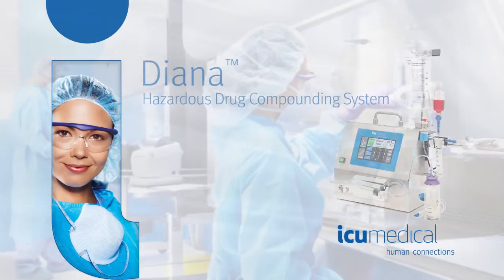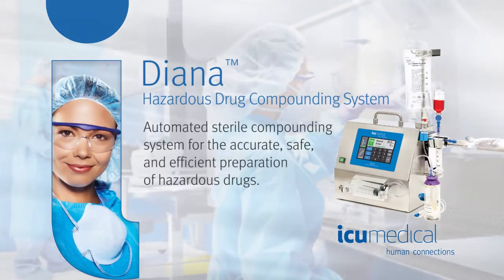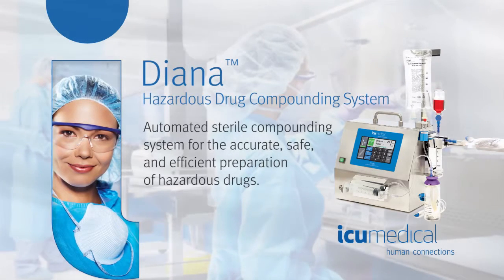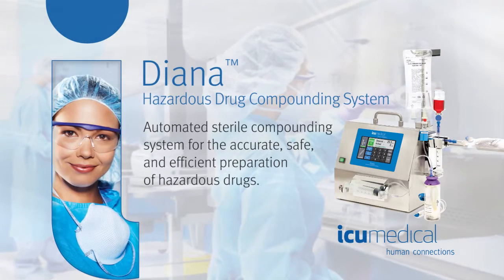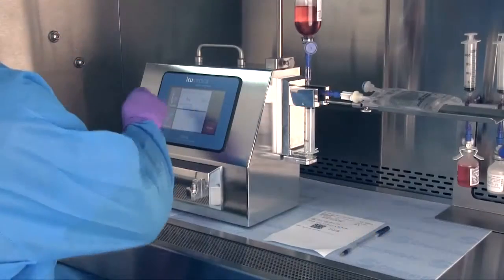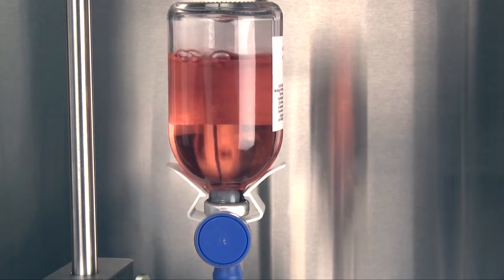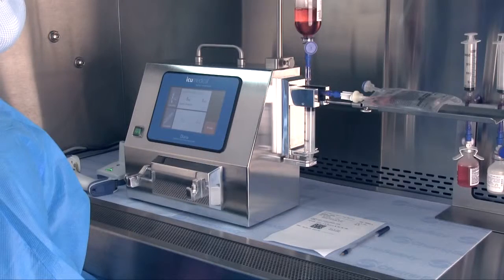ICU Medical presents the Diana Hazardous Drug Compounding System, an automated sterile compounding system for the accurate, safe, and efficient preparation of hazardous drugs. Diana is a user-controlled automated system that keeps pharmacists and technicians in control of the compounding process from beginning to end.